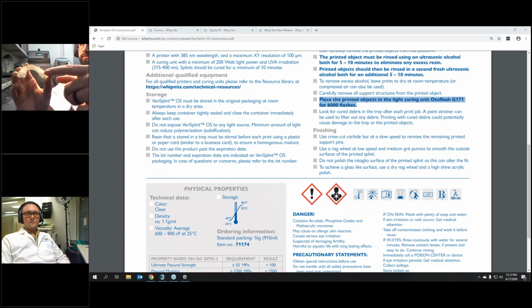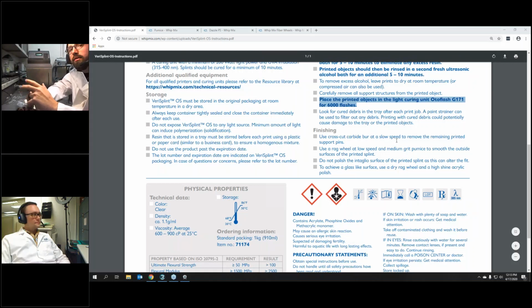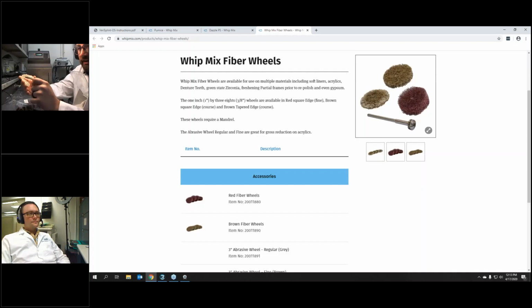Those are all little pieces of supports that are stuck after these supports are broken off. And of course, we've got to take those off. In the IFU, the instructions for use, it says to use I think a cross-cut bit to remove the supports. I actually find that to be a little too aggressive, and this is something that you have a little more freedom to adjust. I actually use fiber wheels. I find that the fiber wheels are an excellent way to remove the supports and remove the scarring from the printing process, and it kind of does a light sanding.